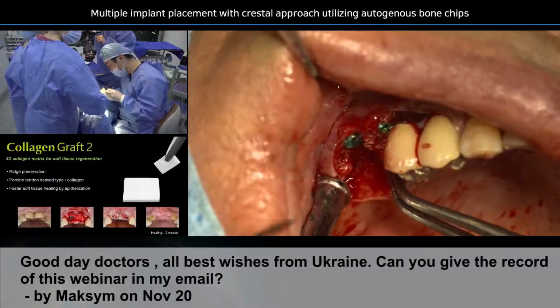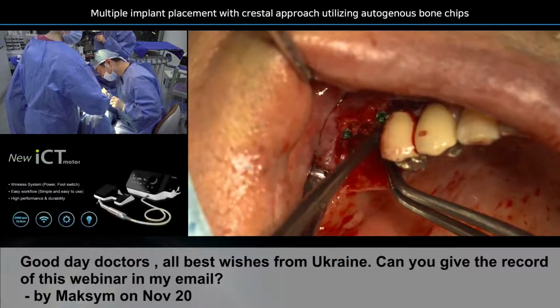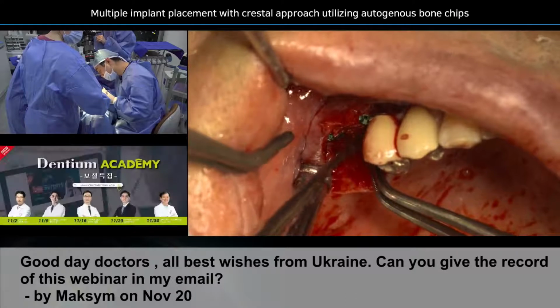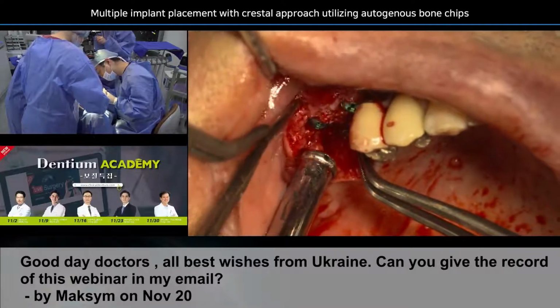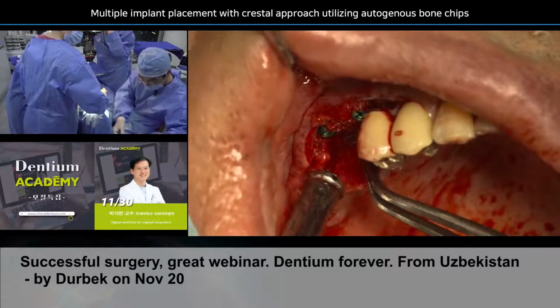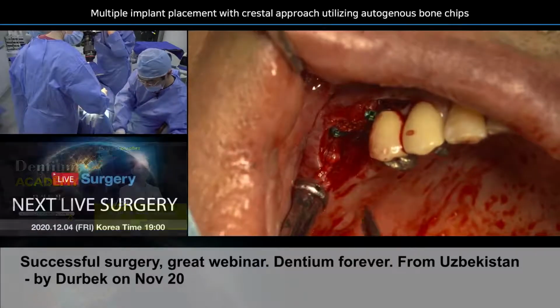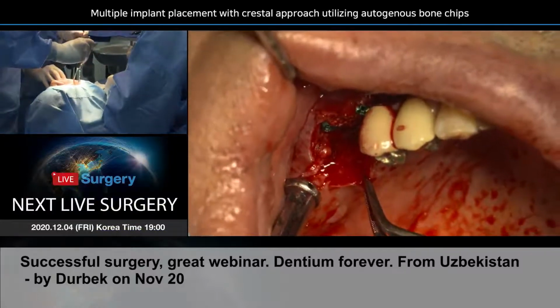And using this Periosteal Elevator, I condense it a little bit more to the fixture site. And what I need is just a small Osteon 3 Collagen for the implant number 17. So I have the Osteon 3 Collagen in a plastic cover, and using the tissue plier, I'm putting it into the vial again.